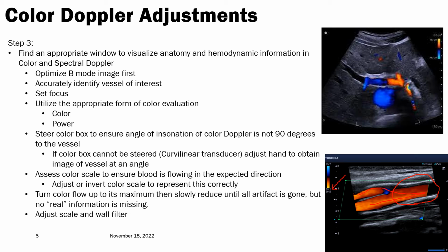Now, the other thing that you can do in this image, this is a carotid ultrasound, and so we know that if the head end is to the left of our image and the feet are to the right, we want that red artery demonstrated as red.